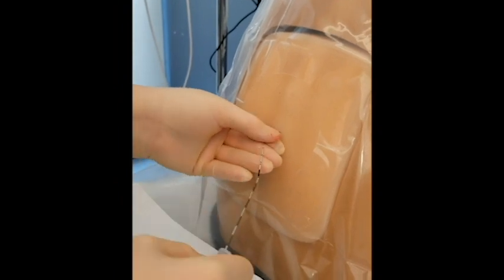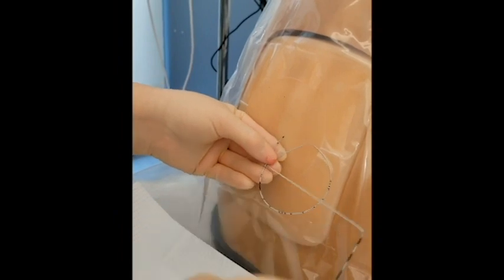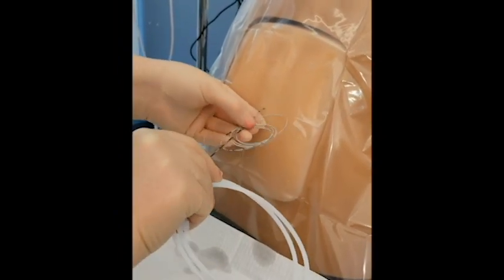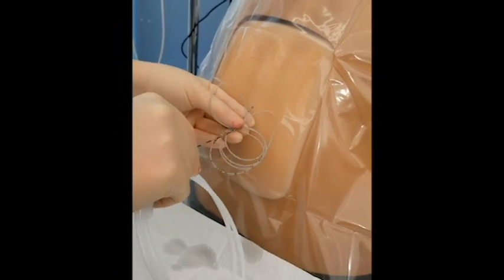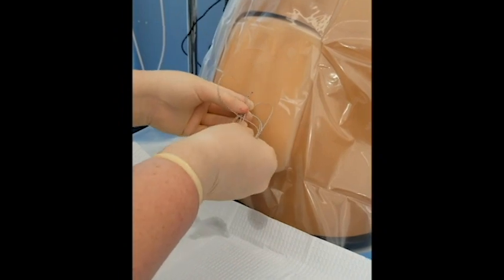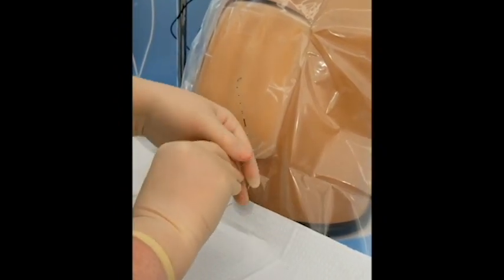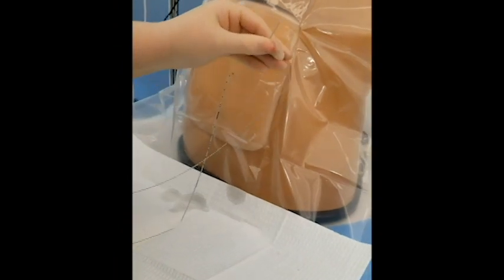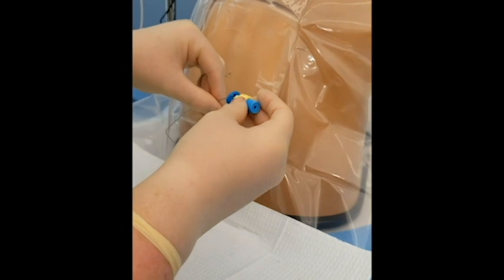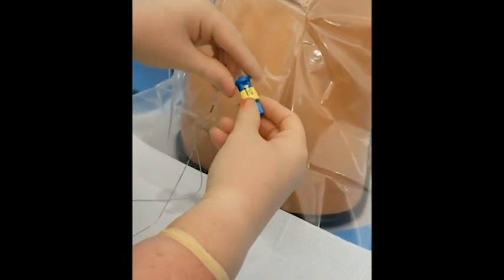Leave in about 3 to 5 centimeters in addition to the number of centimeters from the loss of resistance from the epidural needle. Just add these two numbers together. For example, if you lost resistance at 5 centimeters and you leave in 3 centimeters, pull back your catheter to 8 centimeters. Then attach the adapter to the end of the catheter.